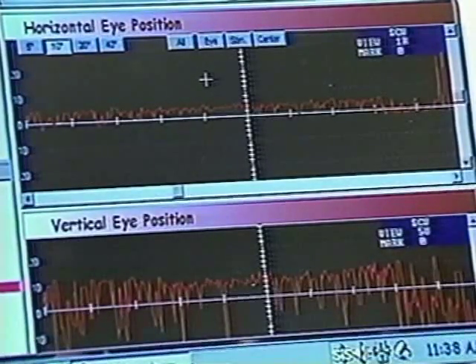In this particular patient, it was of paramount importance to observe the nystagmus as recorded by the infrared goggles, because under ordinary circumstances, especially in the vertical channel, some of this may have been felt to be muscular artifact. The following examples are taken from additional Dix-Hallpike studies and will be discussed at this point.